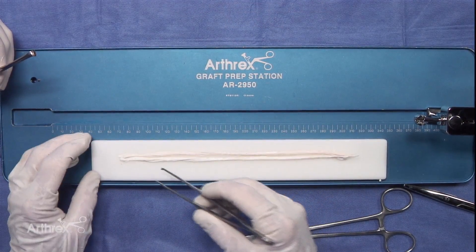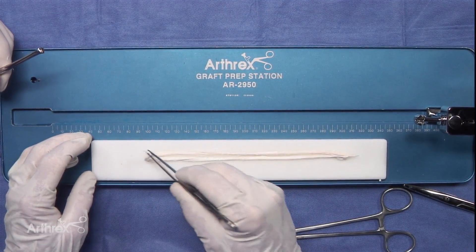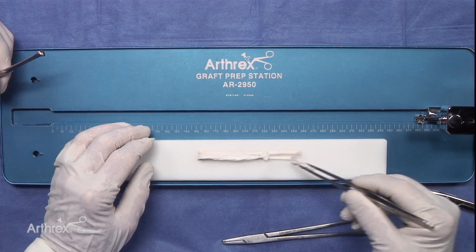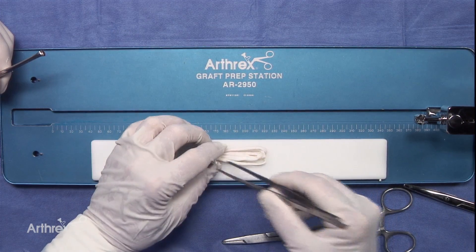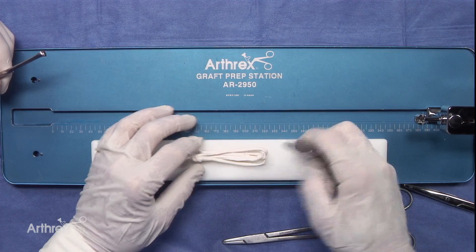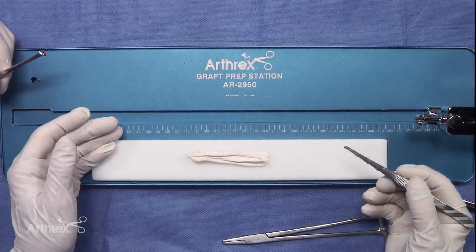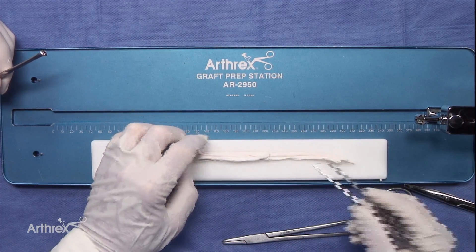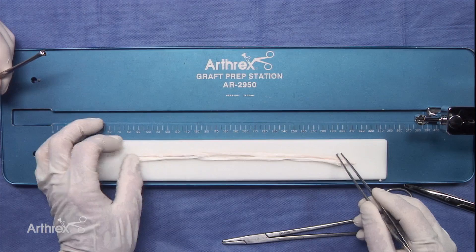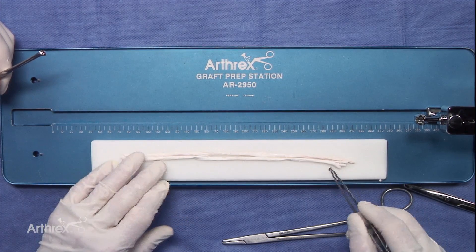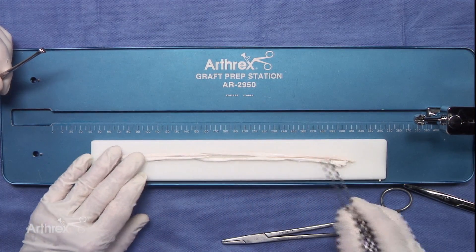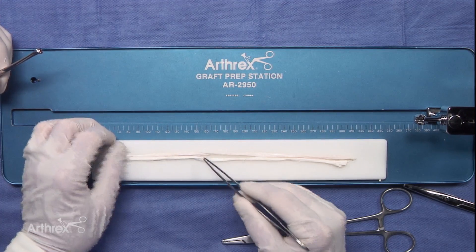Very simply, we're going to show the technique where we make a 6-strand graft. The purpose is to fold that over once, and to fold this then over on top of it, and that'll increase the graft diameter to at least 9 to 10 millimeters. This graft is 210 millimeters to 225. 225 would be the ideal length, and that's going to give us a finished 75-millimeter graft in length.